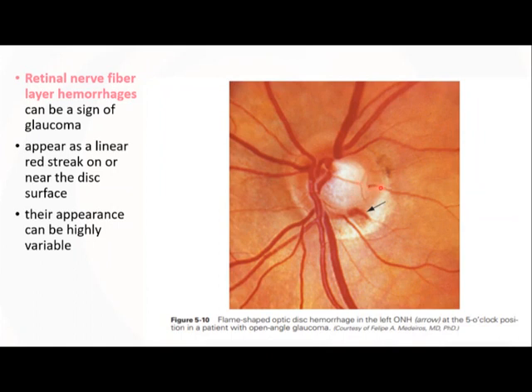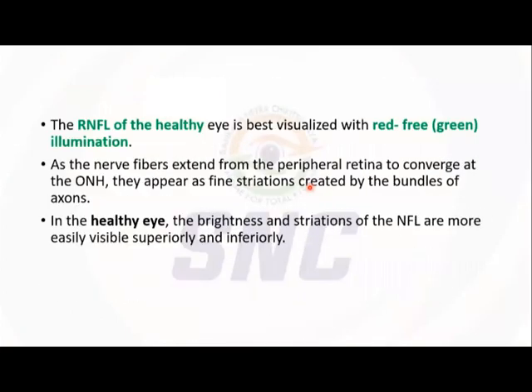Okay, sir. And if you see inferiorly, the vessels are following the contour of the cup and they are bending at the disc margin. I can say cup margin. Yes, there. So they are following the excavating cupping and bending at the cup margin. Actually, here it is the disc margin because the rim is lost at the inferior margin. So that is bayoneting. And superiorly it is bearing of circumlinear vessels.